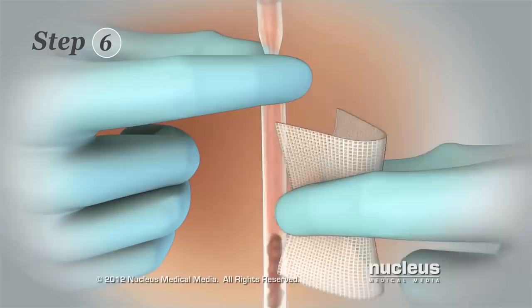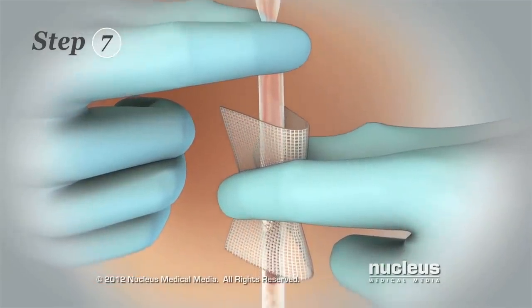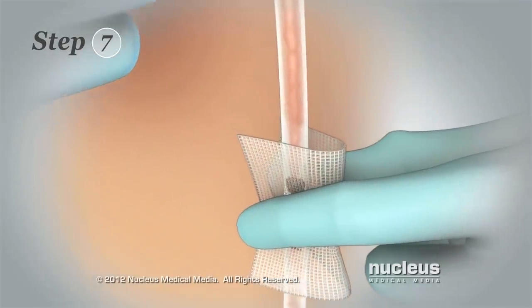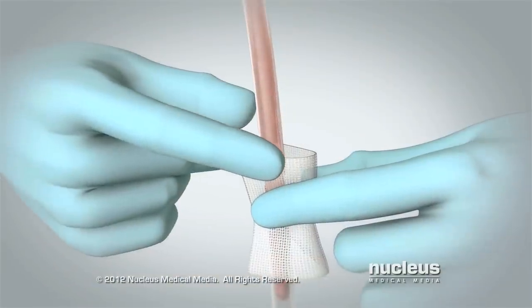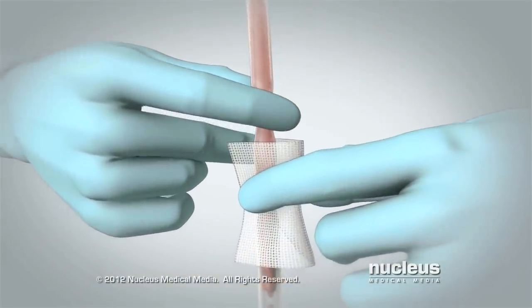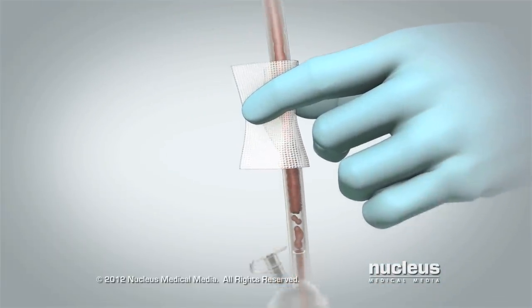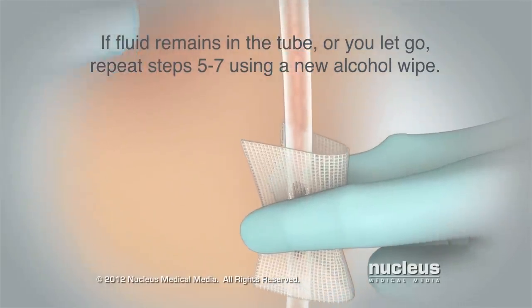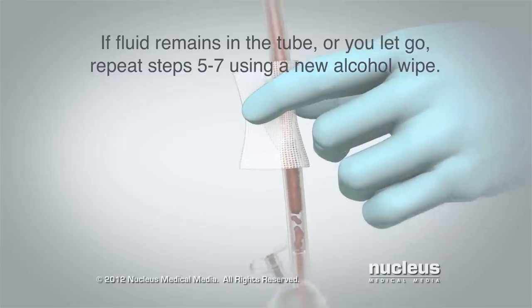Step 6: Use your other hand to pinch the tube with an alcohol wipe between your finger and thumb. Step 7: Slide your pinched fingers along the tube to force any fluid out of the tube and into the bulb. You may need to repeat steps 5 through 7 several times to clear the tube. Try not to let go of the tube between steps. If fluid remains in the tube or you accidentally let go, repeat steps 5 through 7 using a new alcohol wipe.